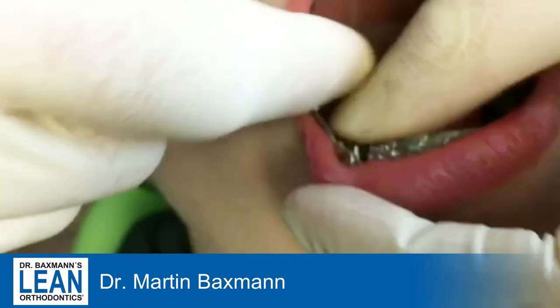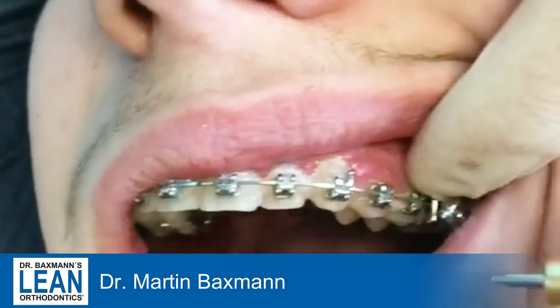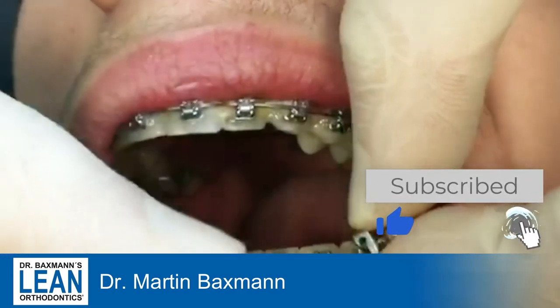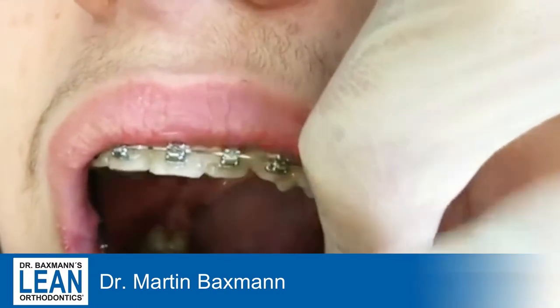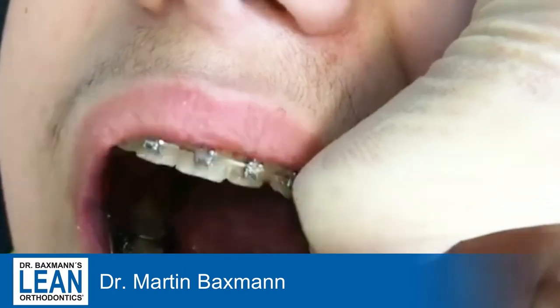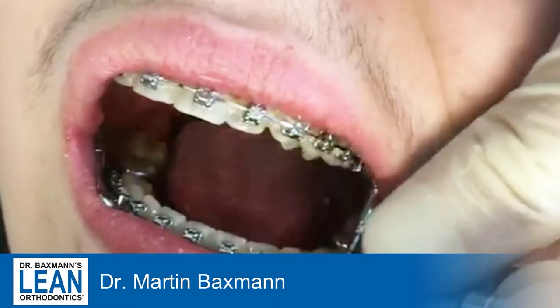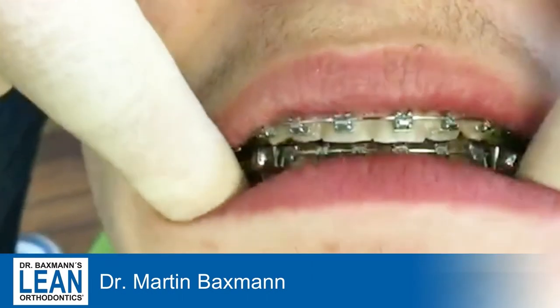Make sure that the whole thing still slides a tiny bit along the wire. Do the same thing for the other side as well — first the upper, then the lower. Make sure that the functional, therapeutic position will be at least Class 1, if not even a quarter Class 3, to ensure you have enough forward posturing of the lower jaw so that the whole appliance will work nicely.